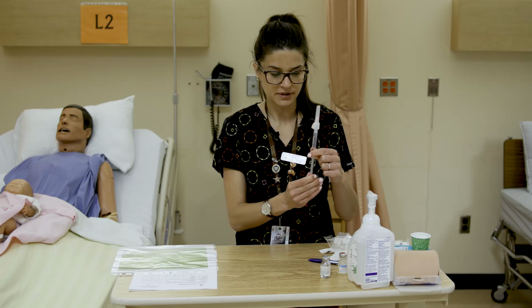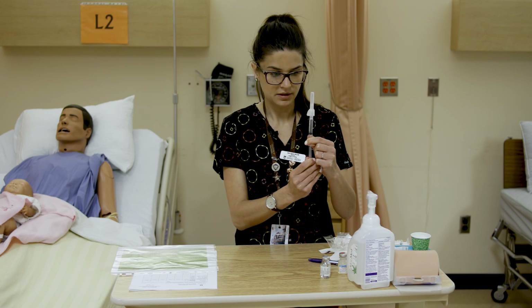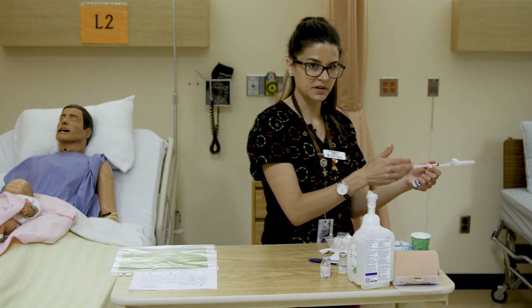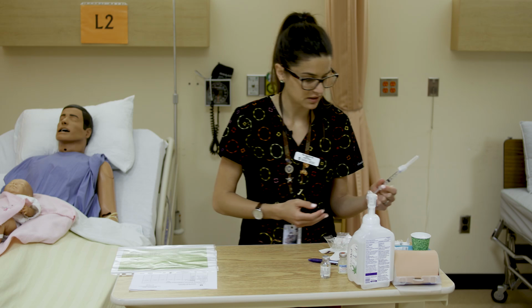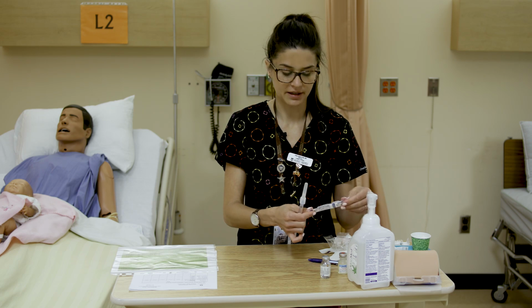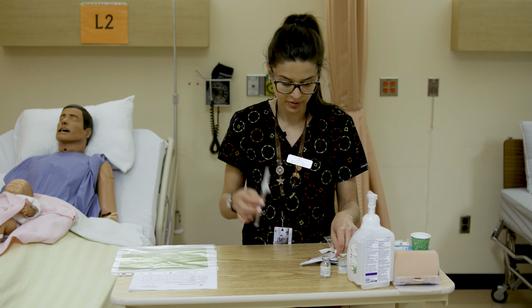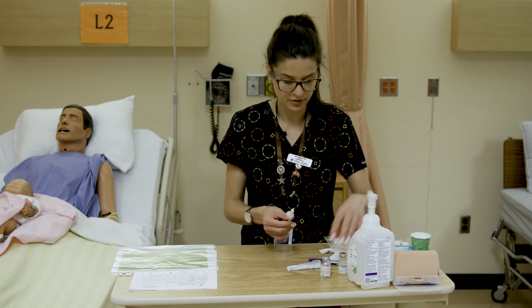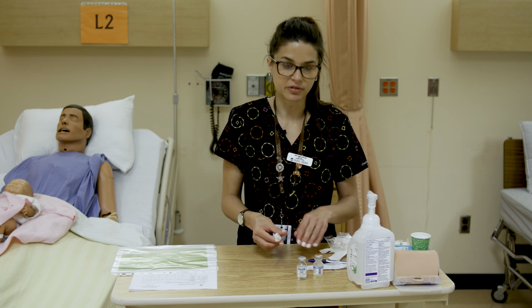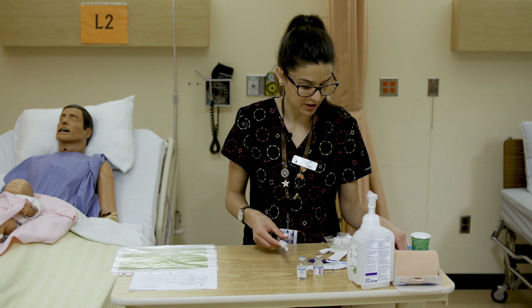So again, now we're just going to want to recalibrate it up to that 2 so that we know we have 2 mLs, and if there's any excess, you could waste that into your medication waste container again. So before we move on, similar to all of our meds, we're going to want to make a medication label for this syringe before we carry on.